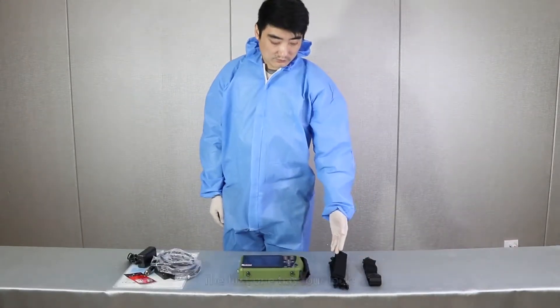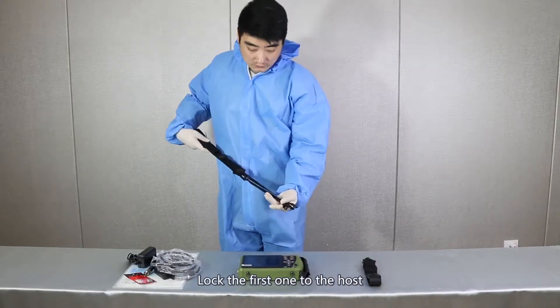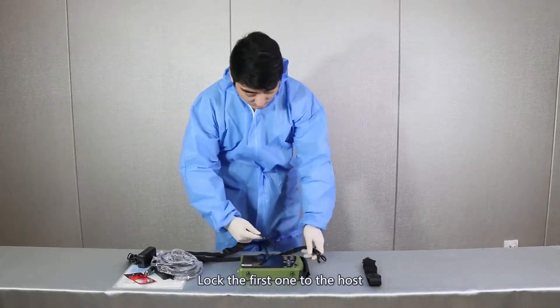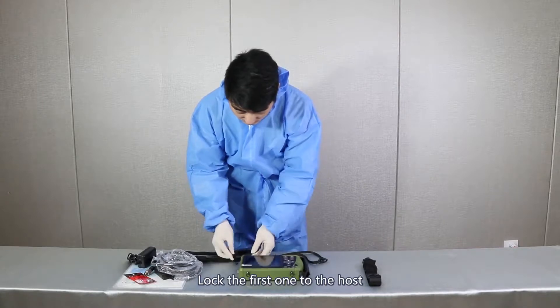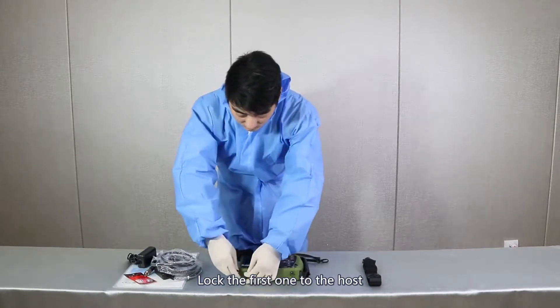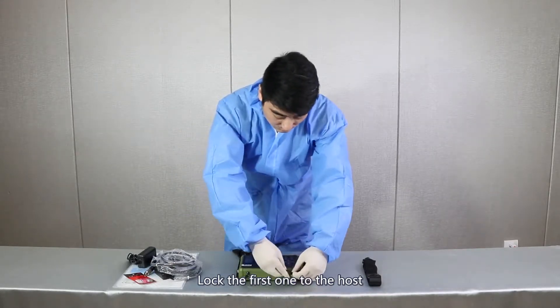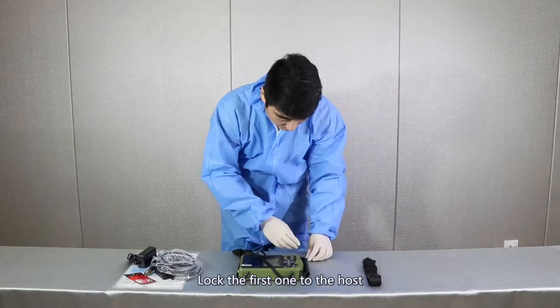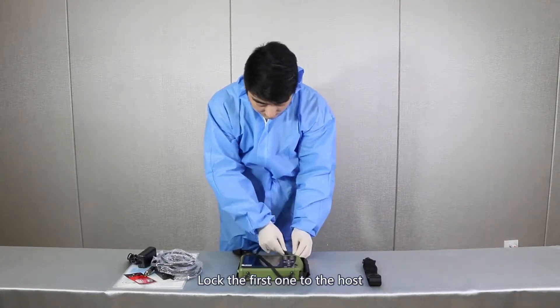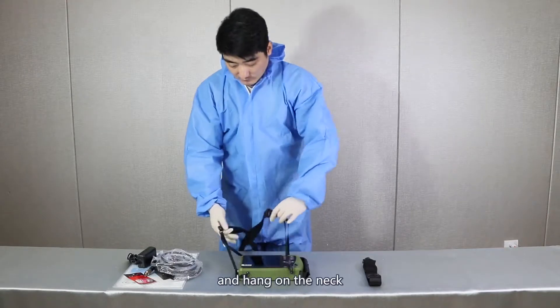There are two straps. The first one has four locks. Lock the first one to the host and hang it on the neck.